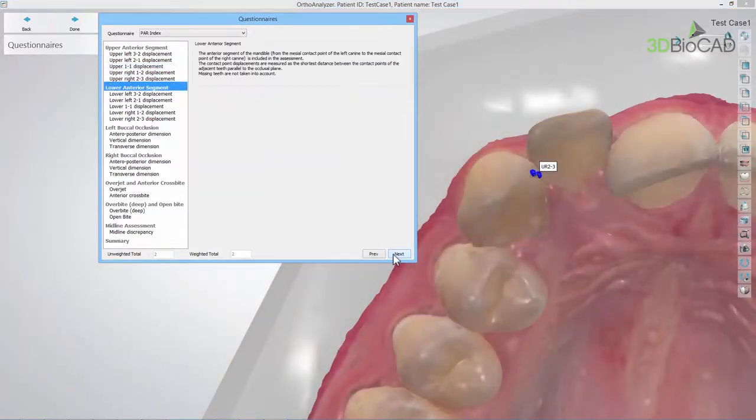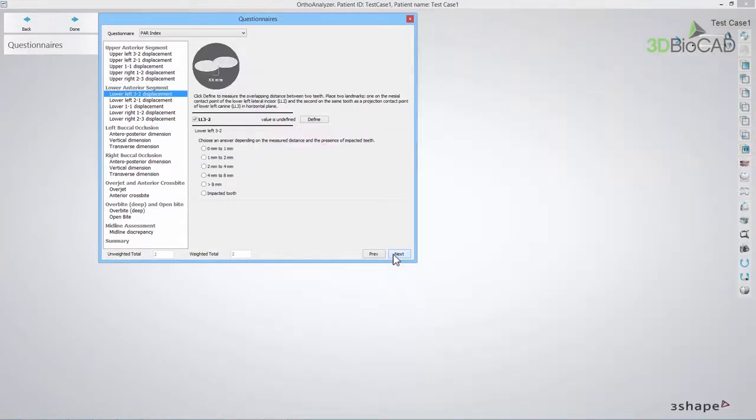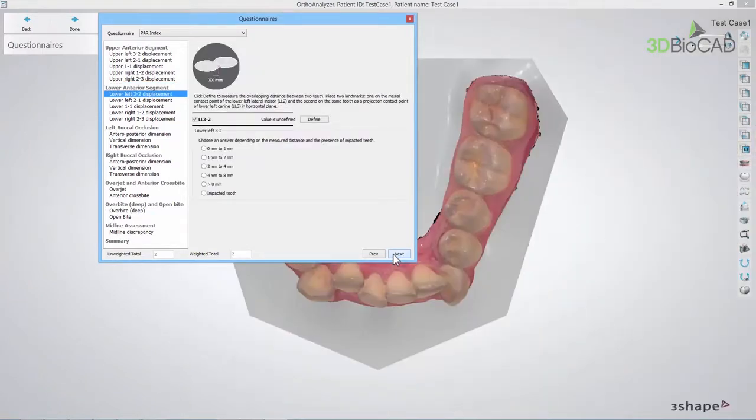When the Upper Anterior Segment is done, the same procedure should be repeated with the Lower Anterior Segment.